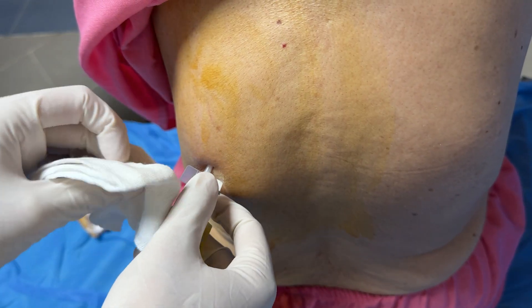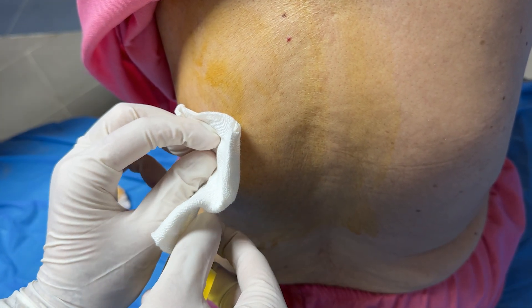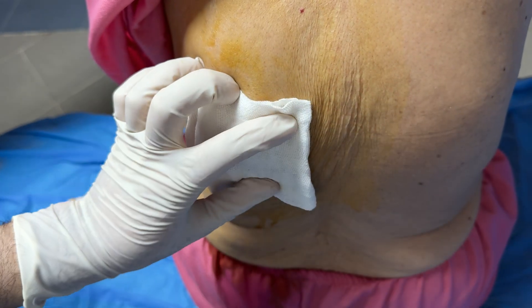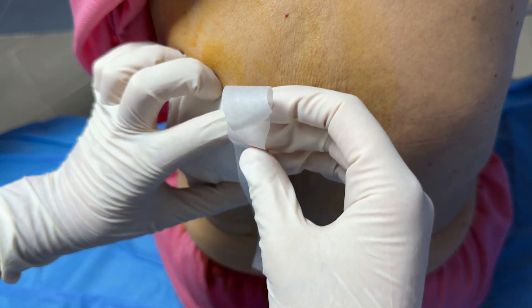After the procedure is done and the fluid is drained, we remove the needle and cover the site with a sterile gauze. We then have the patient lie on her back to put pressure on the side.